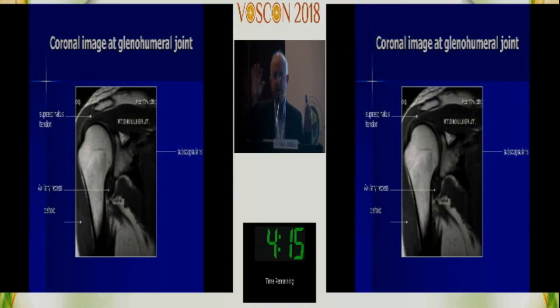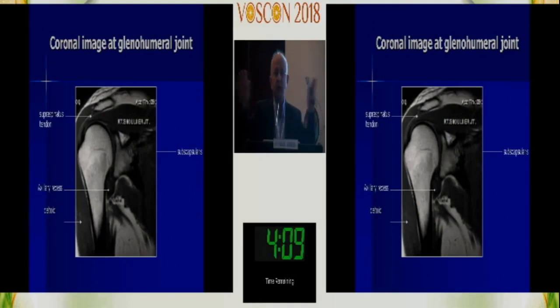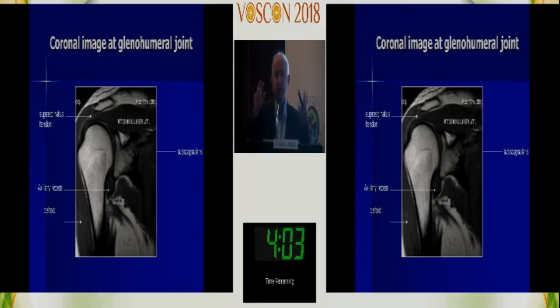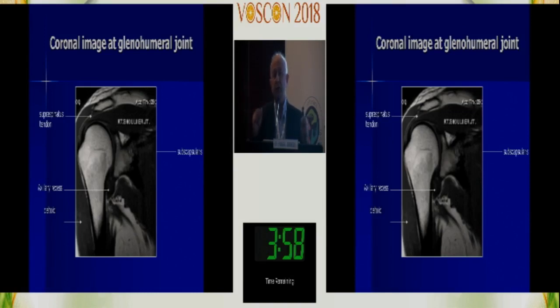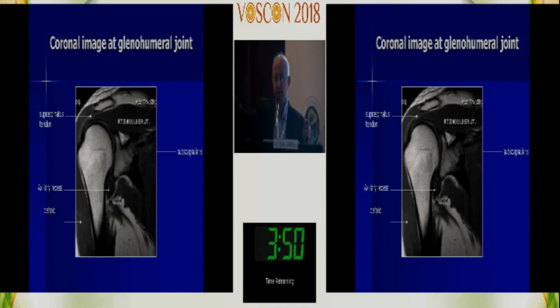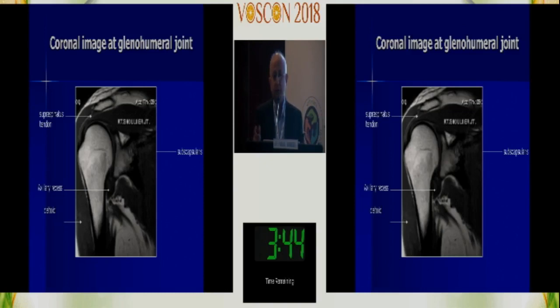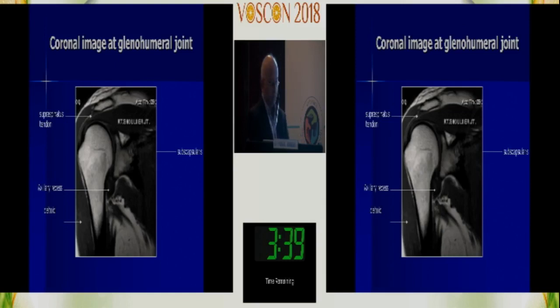When you look at an MR shoulder, you need to have the films up on the board. Radiologists use large screens and put up six films, going back and forth — they are not reporting on one film but collaborating, checking if pathology seen on screen one is also visible on screens two and three. The first sequences to put up are the coronal films, then the axials, then the sagittals. Because the shoulder is in an oblique plane, they're called coronal obliques and sagittal obliques — don't get confused.